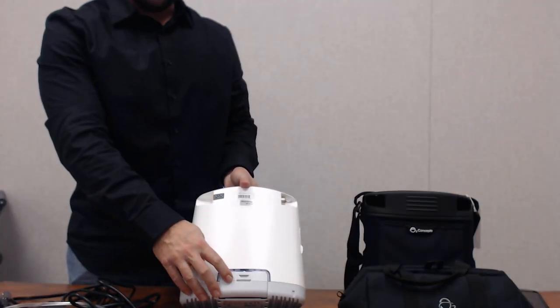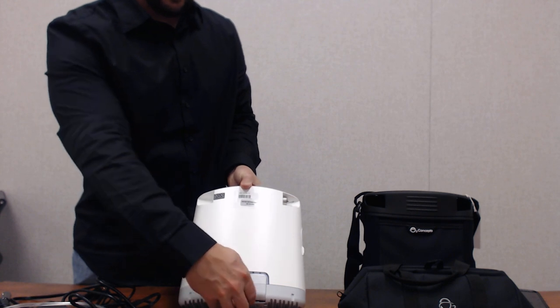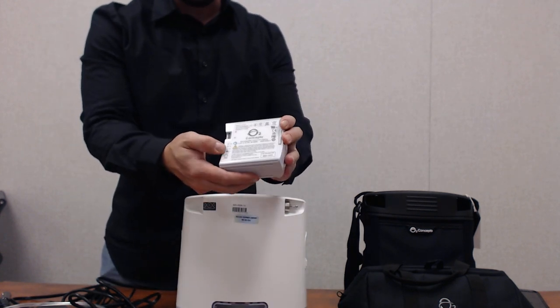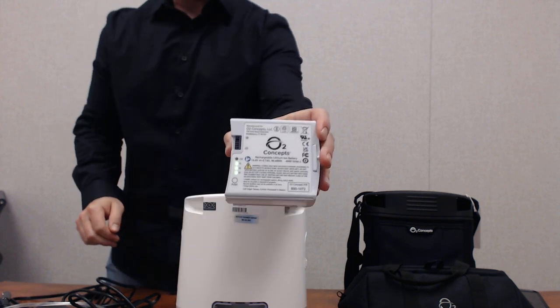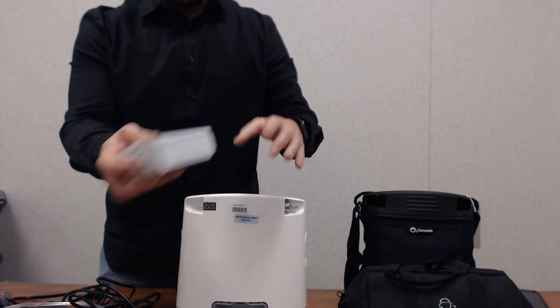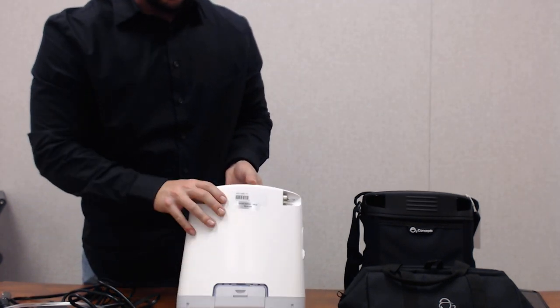Down near the bottom of the device we have our battery. There's a little lever — you push down and the battery slides out. There is an indicator on the battery; just push the button, the battery lights up and shows you how much life is left. This slides right back into the unit and clicks into place.